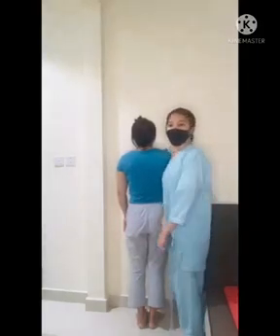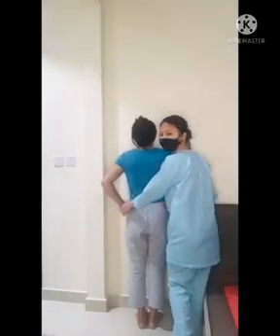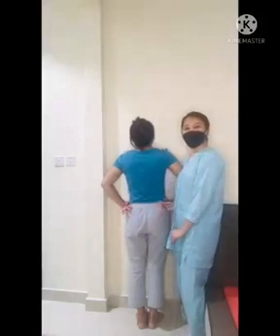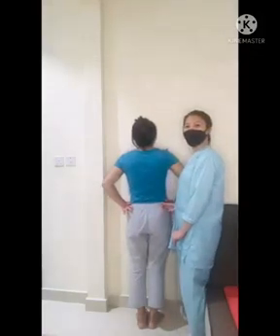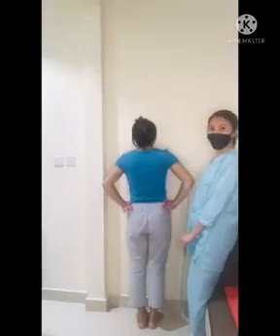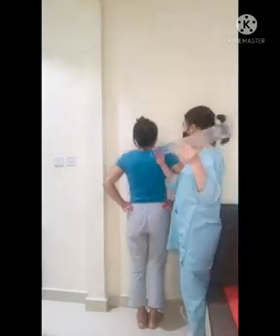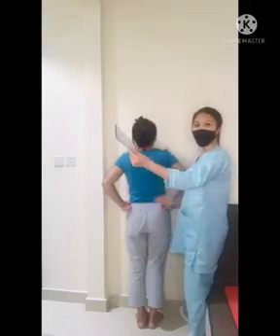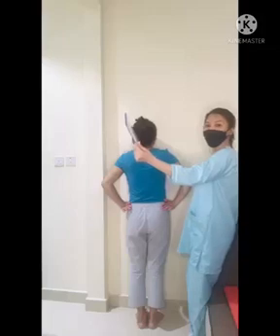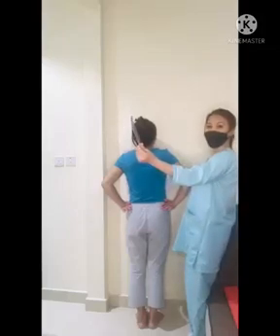Flex the elbow and place the hands on the hips, with the posterior part of the hand resting on the hip. Rotate the scapula away from the rib cage. As you can see, our central ray in this projection is perpendicular to the IR, entering at T7 midway between the inferior border of the scapula.